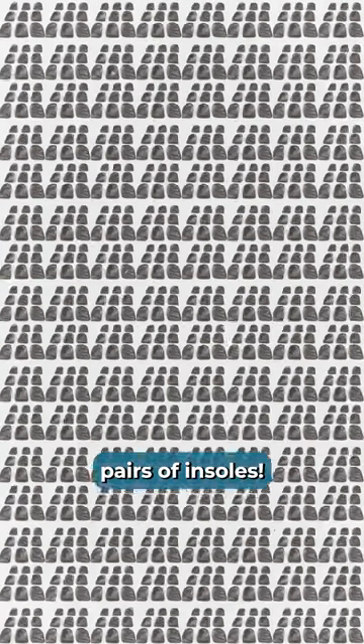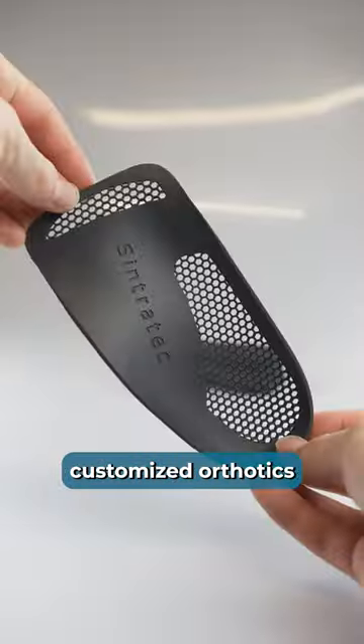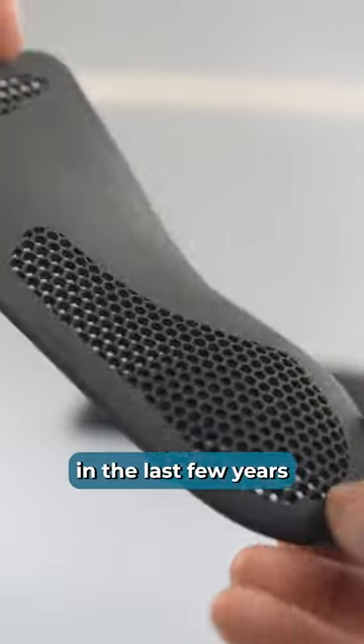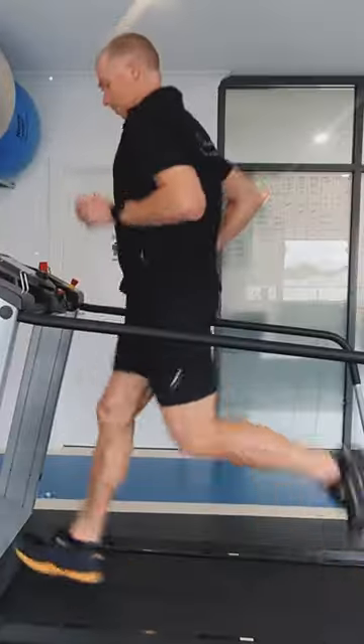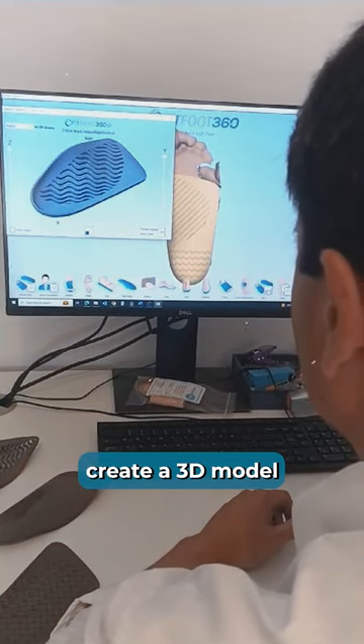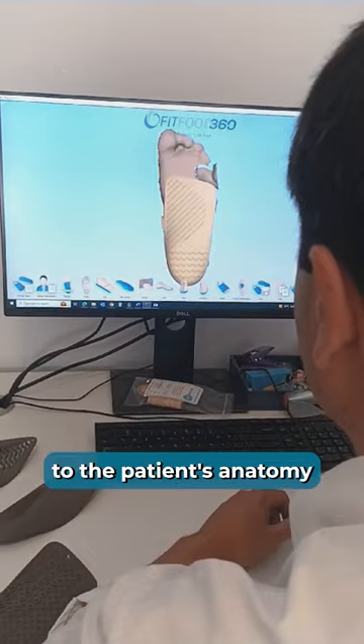More than 1,300 pairs of insoles – that's how many customized orthotics this Australian company has 3D printed in the last few years. Based on a foot scan and treadmill data, the podiatrists first create a 3D model, perfectly adapted to the patient's anatomy.